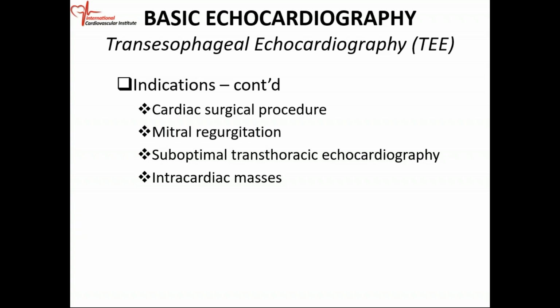Patients with aortic valvular pathology, not so much. The transthoracic echo usually is sufficient. You're not going to gain much by doing a transesophageal echo. In rare cases, you're looking for dissection going down to the valve and things like that, or vegetation of the aortic valve.